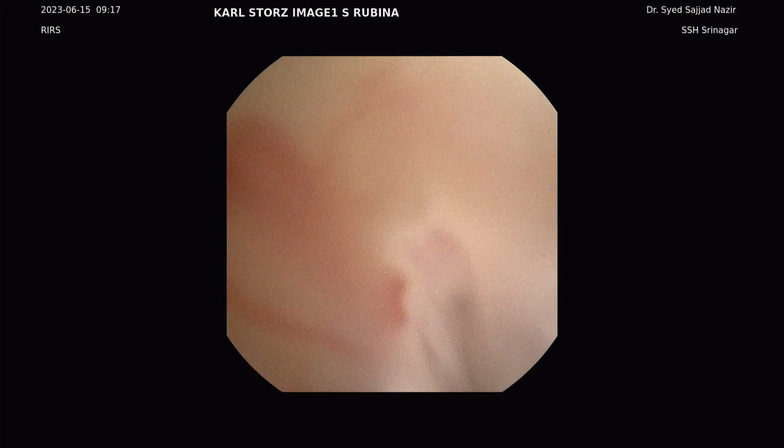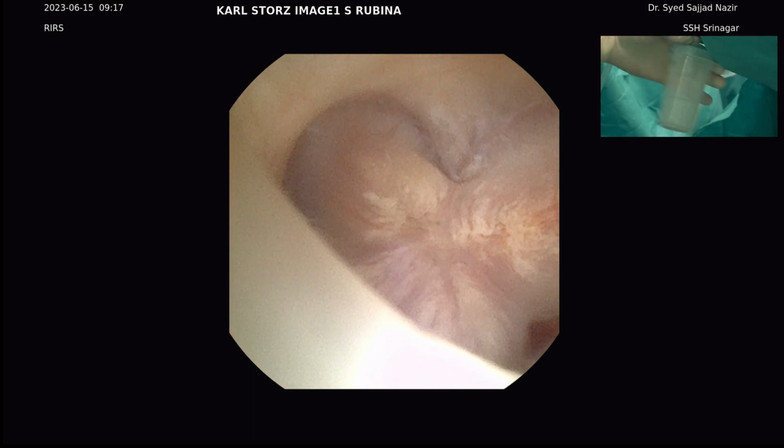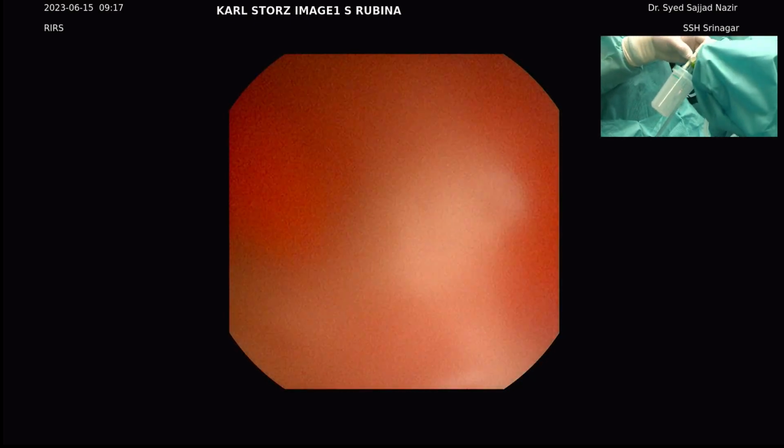Stones also has a disposable. Yes, sir. So these are the things we see once we have that patient with the stents. You just keep it for 3 or 4 minutes till the water goes on, and then you will see the good vision. So this is a clot which is because of the previous stent.